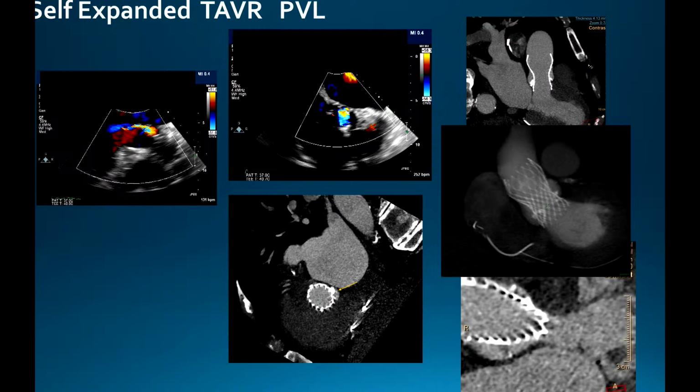Again, Dr. Zoghbi mentioned not only is quantification difficult, localization is very difficult. As you know, it could be just a punctate area. My take, from the experience I have seen, is always find the calcium. If you have a calcific deposit in the annulus, likely that's where the leak is going to be.